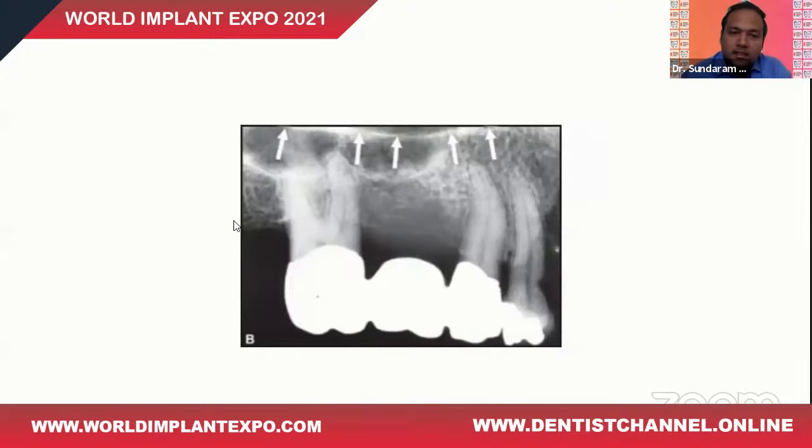And this is another radiograph of the upper posteriors, wherein you can see a well-defined radio-opaque line demarcating the maxillary sinus. And what is the next line that is present over here? This is the superimposition of the floor of the nasal cavity. So this is a problem, dear viewers, with two-dimensional radiographs. You get a lot of superimposition, a lot of soft tissue shadows that can actually hamper the images or the information that you can actually get out of a radiograph.